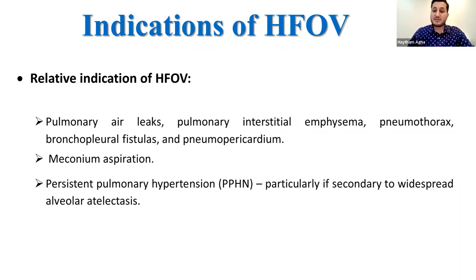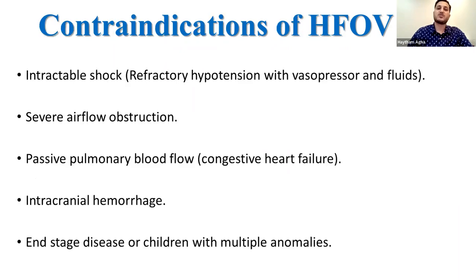leak. Persistent pulmonary hypertension, we'll talk about high frequency because it's one of the good points of high frequency ventilation in treating persistent pulmonary hypertension of the newborn. A contraindication of high frequency: if you have a hemodynamically unstable patient, it's illogical to shift him from conventional mechanical ventilation to high frequency mechanical ventilation.